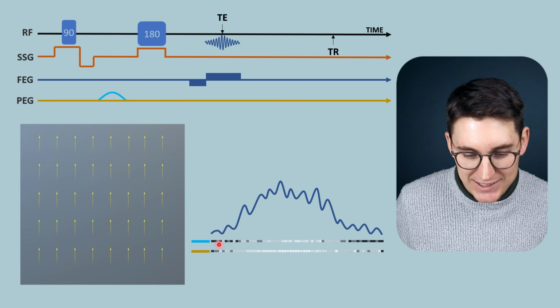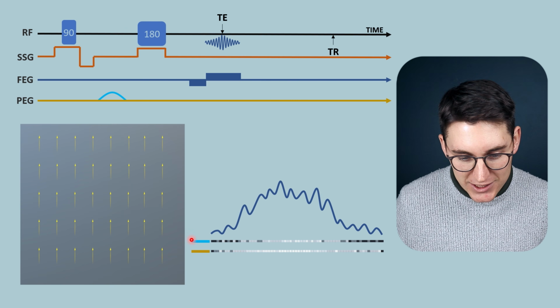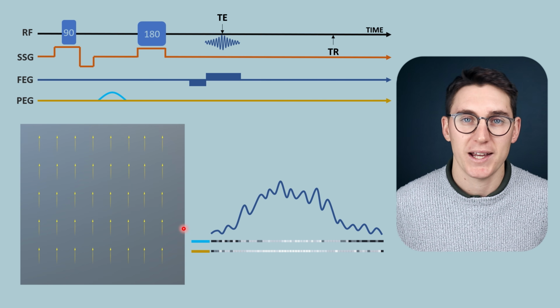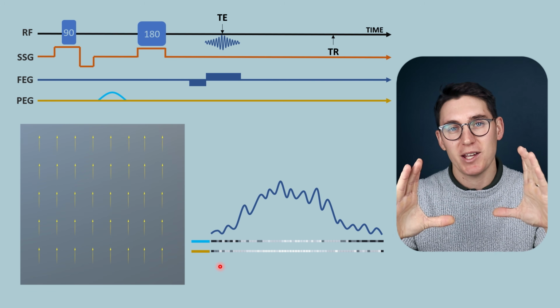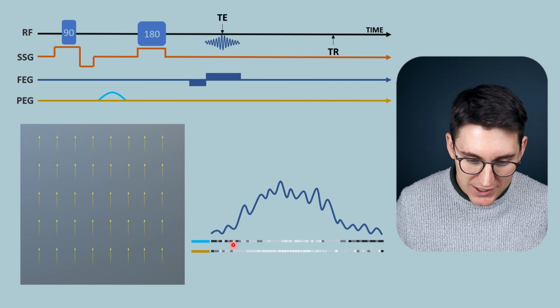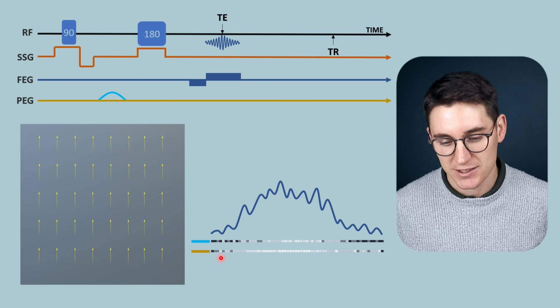The second data set that we've acquired has now taken the net magnetization vector over time, but it's acquired that when there's been a certain amount of phase encoding applied in the y-axis direction. Now both of these are encoding for the same image. The anatomy that we're imaging in that specific slice hasn't changed at all. The only thing that's changed between these two data acquisition periods is the amount of phase that we are introducing into the y-axis.